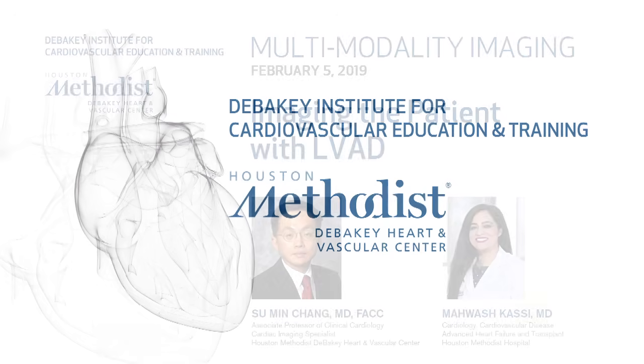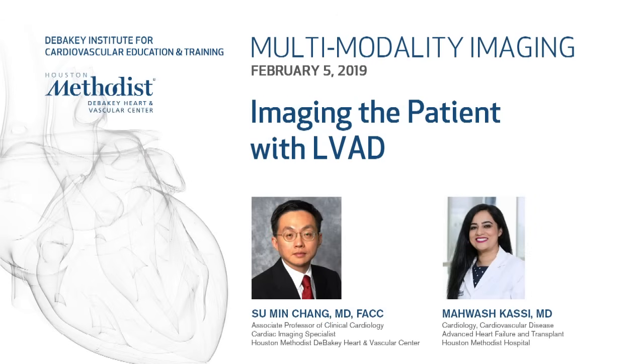I'm going to talk about multimodality imaging and left ventricular assist devices. My role here is to talk more about echocardiography, and Dr. Chang is going to talk about CT. In the initial part, I'm going to talk a little bit about what I expect from an echo when it's read from an LVAD, and what I'm expecting in terms of images.